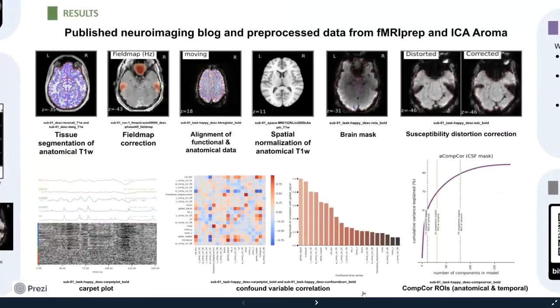This is our results for what we've currently done for this semester. We currently have the results from pre-processing with fMRIPrep. One of the reasons fMRIPrep is so useful as a neuro-preprocessing tool is that it outputs a visual quality control, one HTML file per subject, in addition to the derivatives and the confounds, which are derivatives describing signals and noise that can be used to take denoising steps.